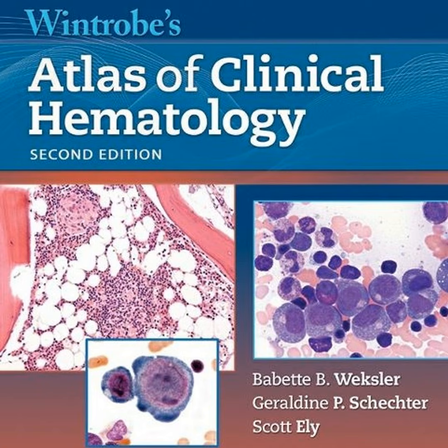What's the definition for that? If you find more than 5% of them have 5 or more lobes, or if you even see 1 or 2 cells with 6 or more lobes, that finding should immediately make you think of a vitamin deficiency.